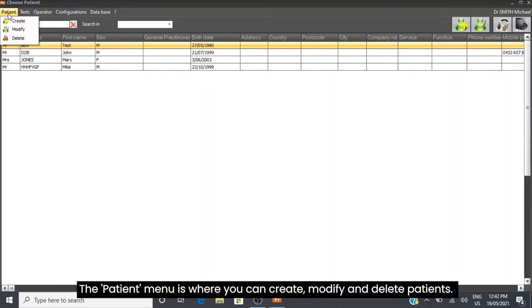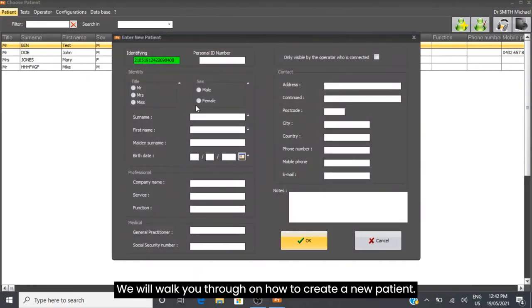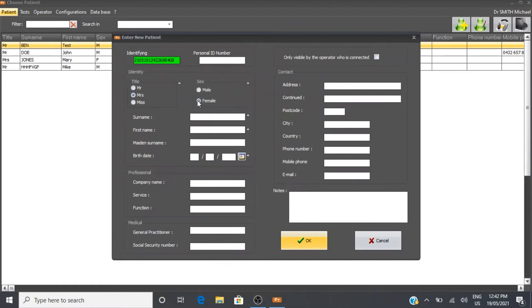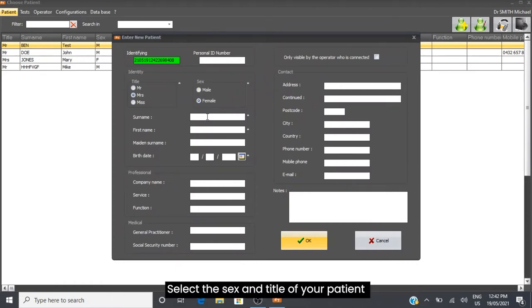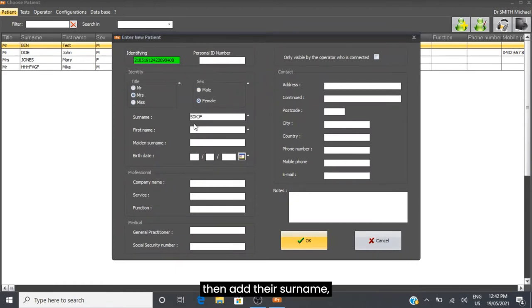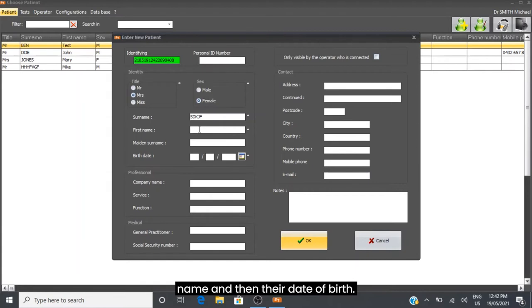The Patient menu is where you can create, modify, and delete patients. We will walk you through how to create a new patient. Select the sex and title of your patient, then add their surname and name.